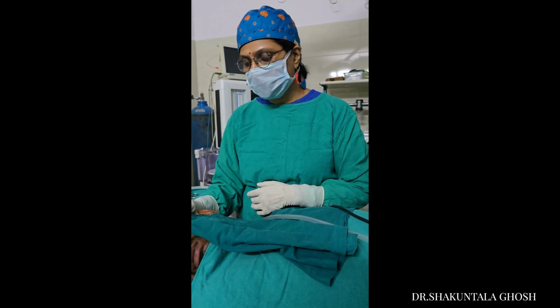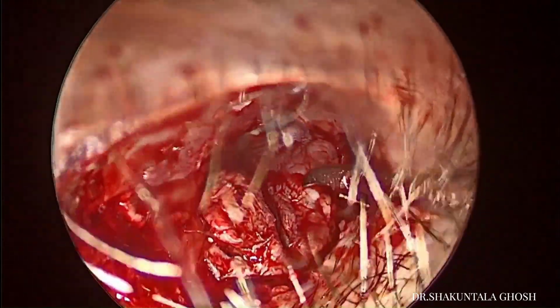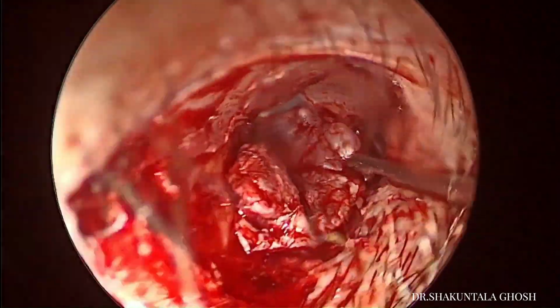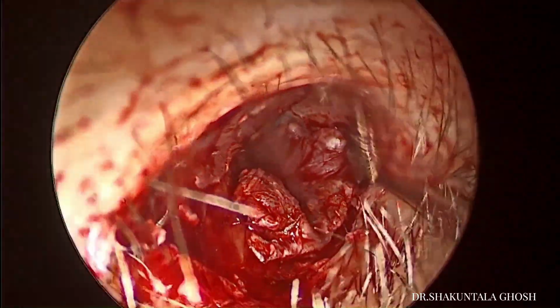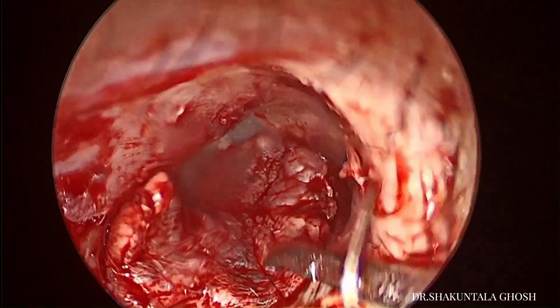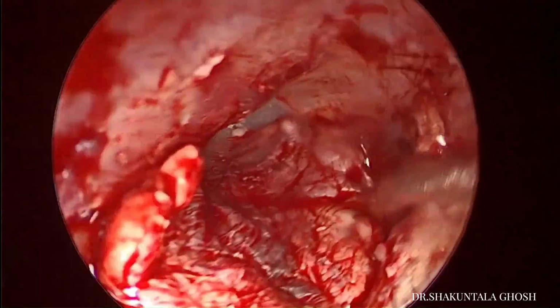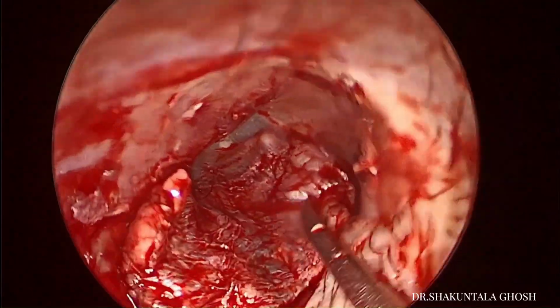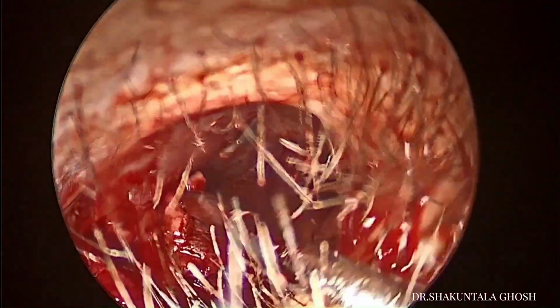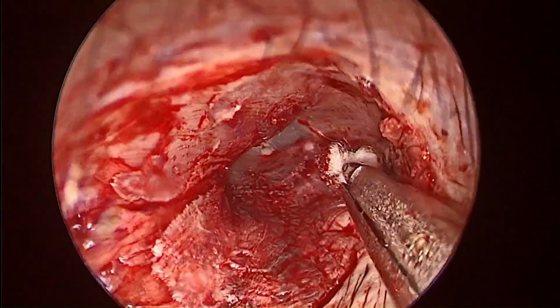Okay. So after having ensured that the patient is able to hear well, even responding to whispering, I reposit the flap and I place gel foam to keep it in place. So I have got satisfactory results. Presently the patient is able to hear well. So I just clean out the excess blood and I place gel foam and pack the ear.